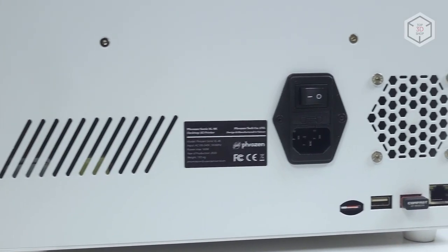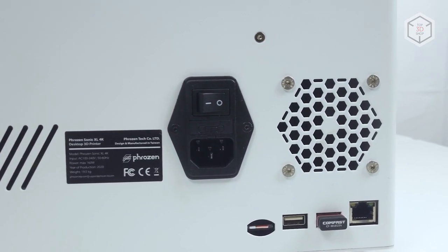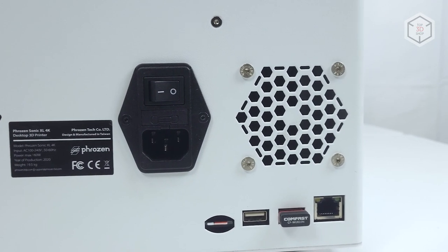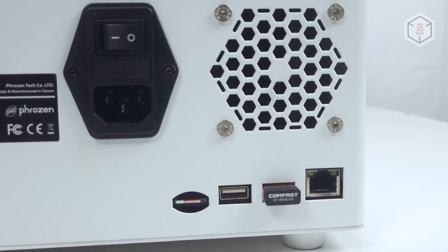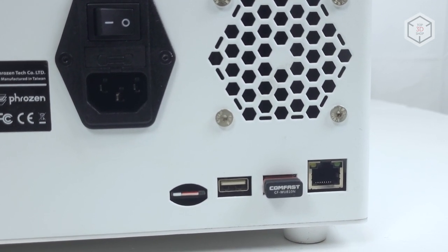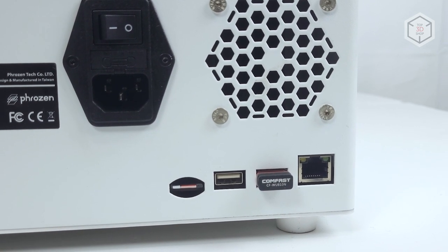In addition to a pair of ventilation holes, a power port, and a power button, two USB ports are located on the back of the printer. One of these ports can host the Wi-Fi dongle that comes with the printer. The second port can be used for a regular USB flash drive for local printing. There's also an Ethernet port for a wired network connection in case Wi-Fi isn't an option.